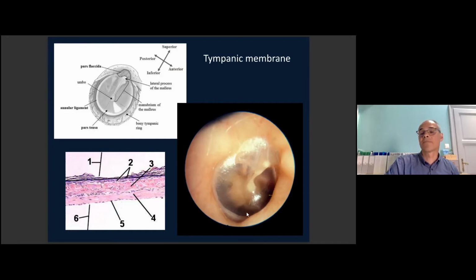This is an endoscopic view of a classical tympanic membrane, right side: handle of malleus, pars flaccida, pars tensa. But this is not a healthy tympanic membrane. If the connective tissue becomes thinner, in case of atelectasia between both epithelia, the tympanic membrane becomes transparent, and after that you can see very well all the structures: the auditory tube, the hypotympanum, round window, and oval window.